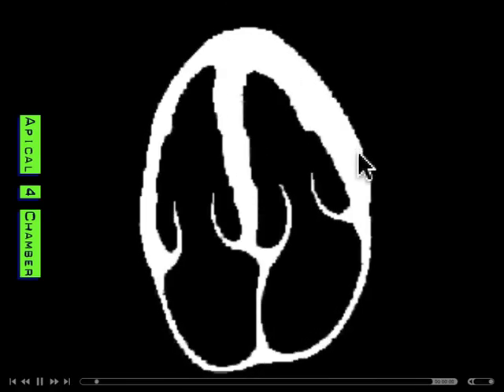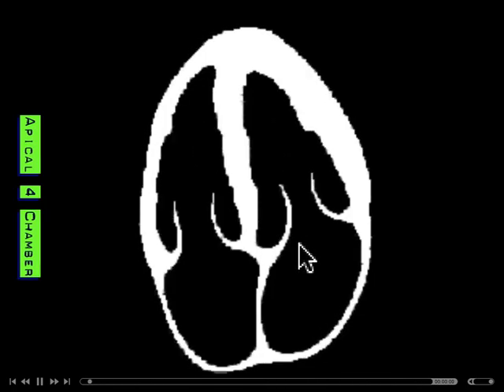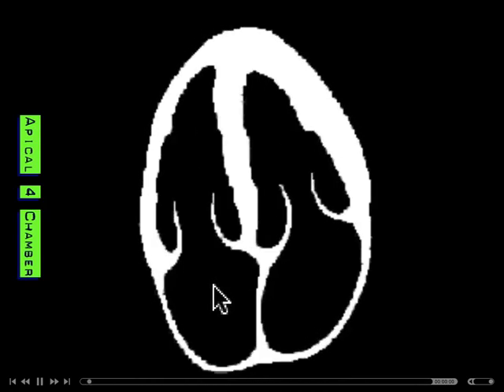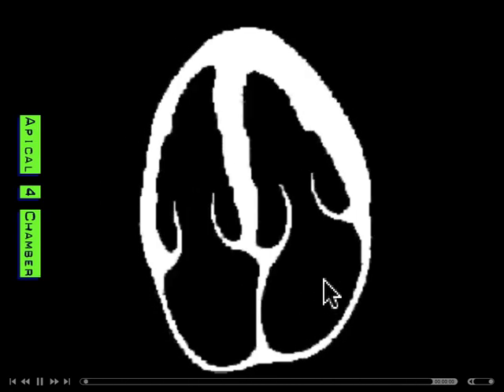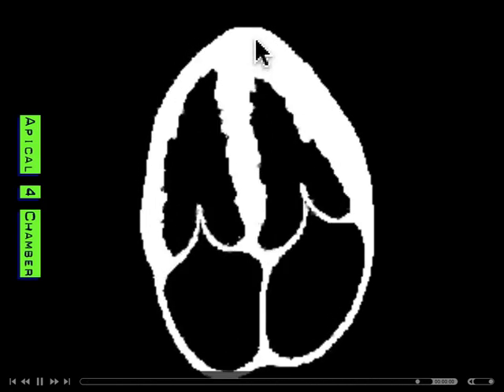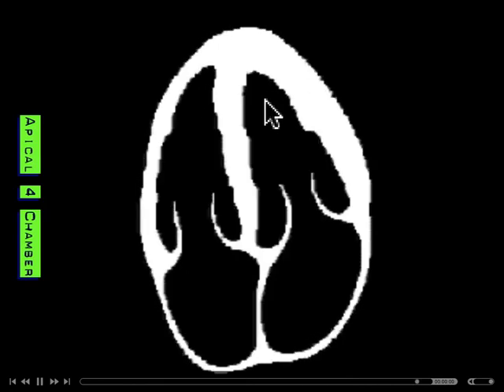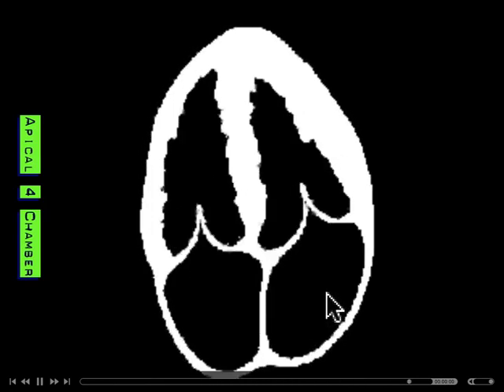Here's a schematic of the apical four chamber view — the probe is up here, the sector of sound comes out like this, apex of the heart here. If we put color here: left atrium, left ventricle, right ventricle, right atrium. The indicator is to the patient's right, making this the right side of the heart. Blood flows from the left atrium into the left ventricle — with color flow, red would be flowing towards the probe and blue would be flowing away from the probe.